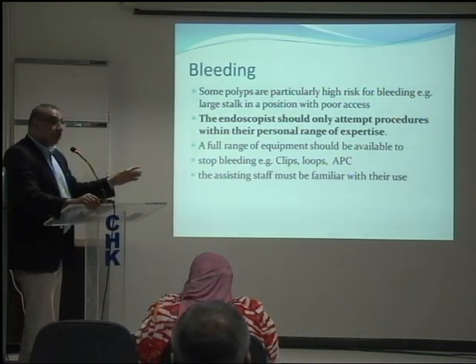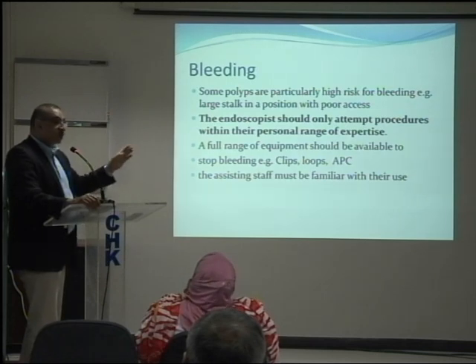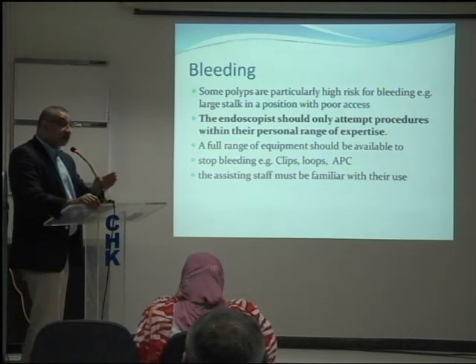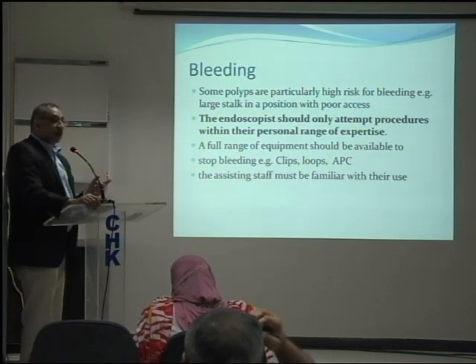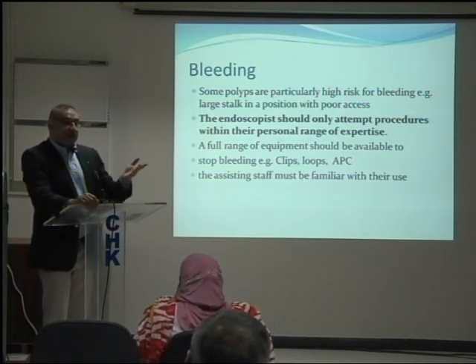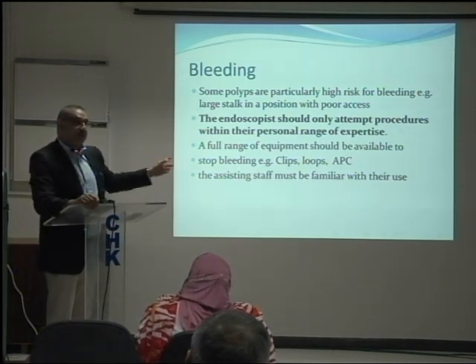So, as you all know, the suction channel of the colonoscope is at the 5 o'clock position. So when you are carrying out any therapeutic procedure, bring your polyp to the 5 o'clock position. It should be within your easy access. If you can't get easy access to it, or if you don't feel that you are able to take that big polyp out, then send it to somebody who is more experienced and able to do it. If you are a lightweight boxer, you do not go and fight Mike Tyson or one of the heavyweights because he'll knock you out. So if you are a lightweight colonoscopist, don't do heavyweight jobs.